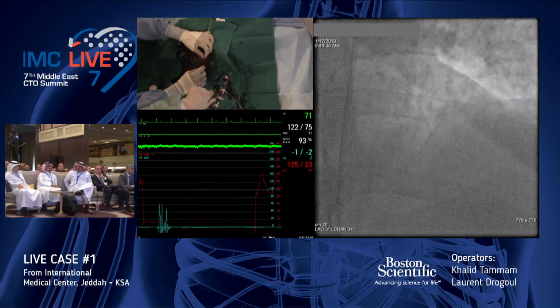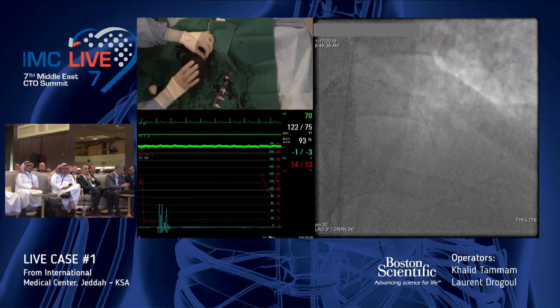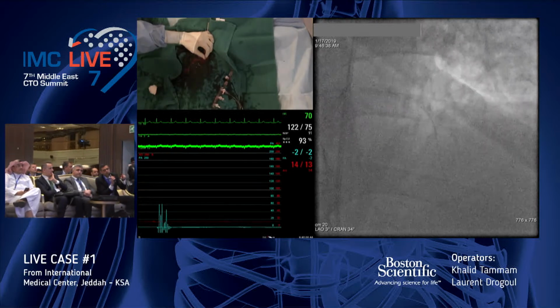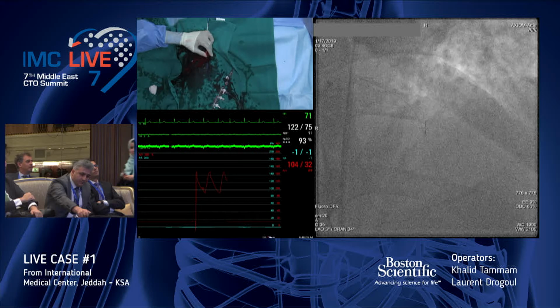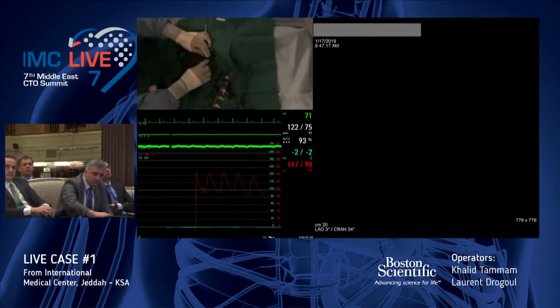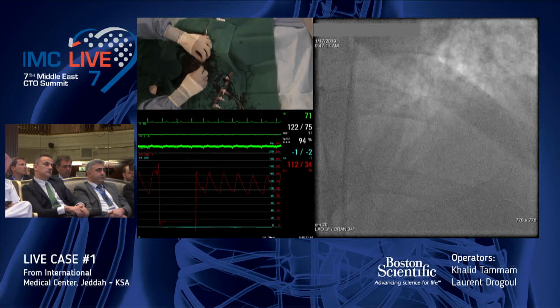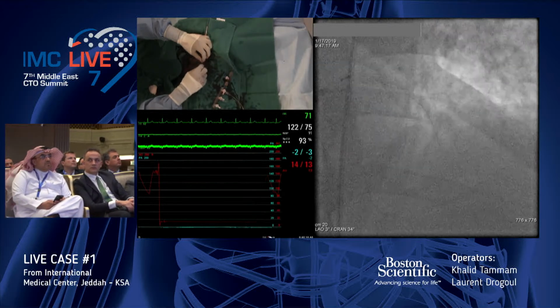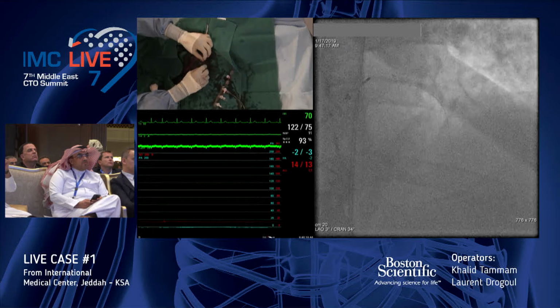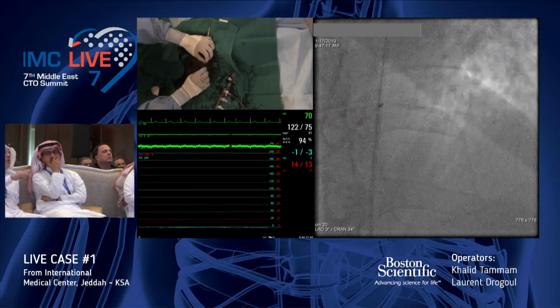Alexander, one thing is, I'm not seeing any more the diagonal that was at the proximal cap. I wonder if it's lost. If you put a wire there before you start doing more things, you don't lose it. I don't know if you have listened to Manos' remarks about the proximal diagonal. Because we are concentrating on the IVUS, just tell me.